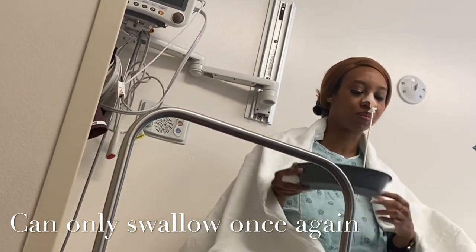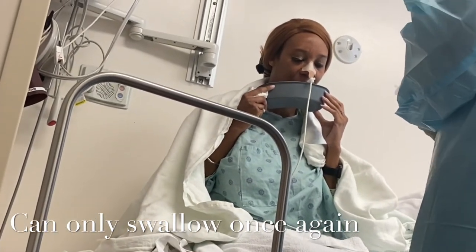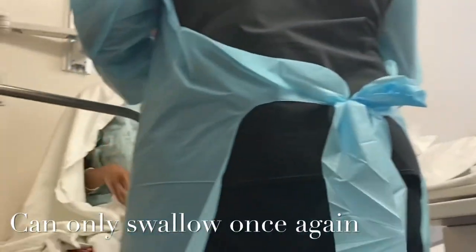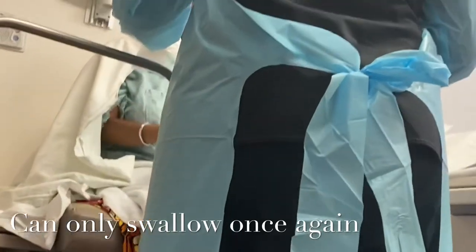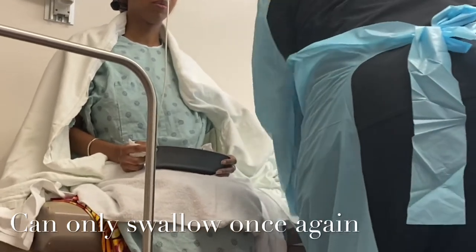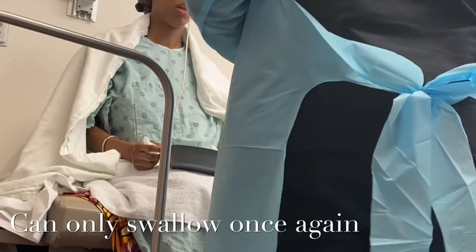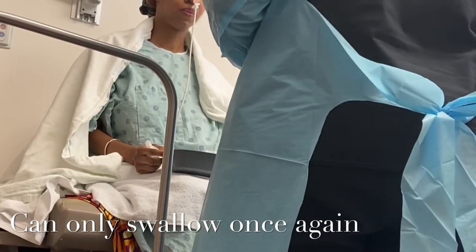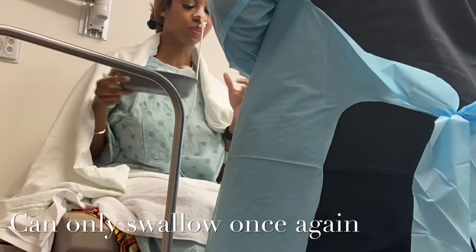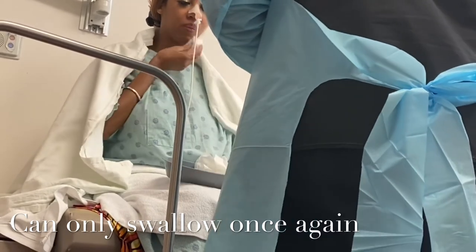Five quick swallows. It's just going to be one right after the other, okay? I'm going to say swallow, swallow, swallow, like that. Okay. Real gross. I know, sorry. So the full swallow doesn't feel like it's going down. Mm-hmm. And you'll be able to look at those numbers and see what's happening. Tell me when you're ready, and we're going to do the five quick ones. Okay.